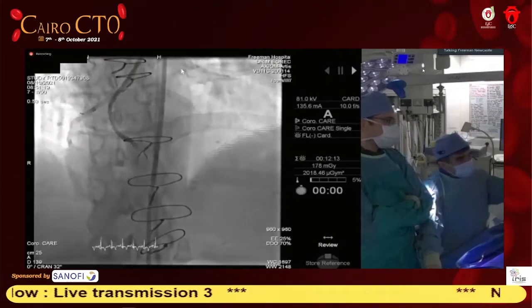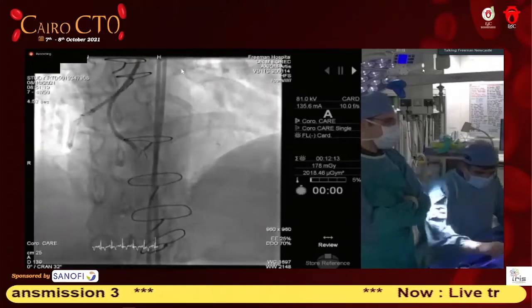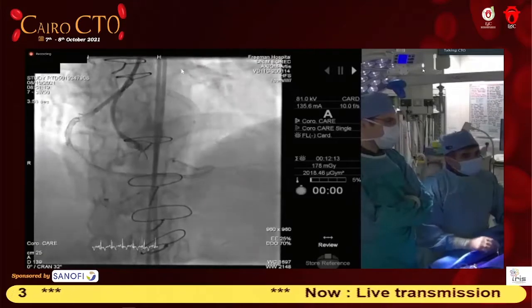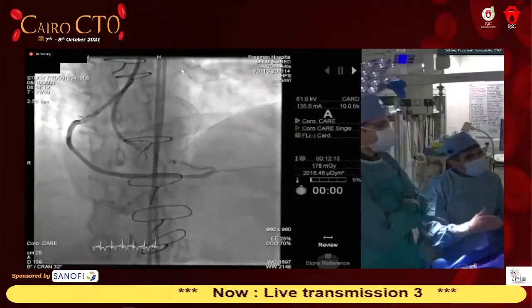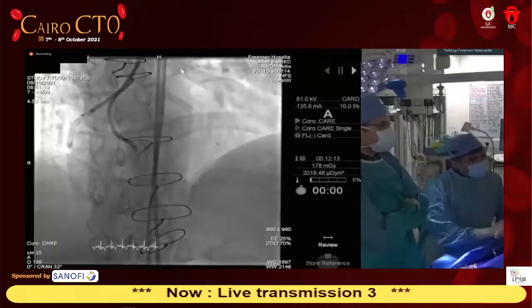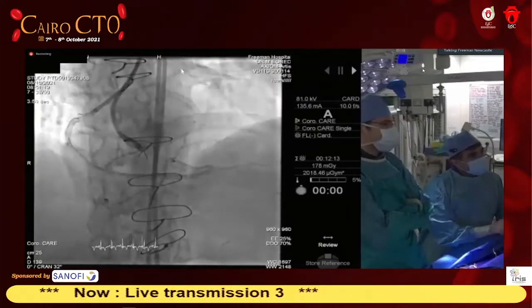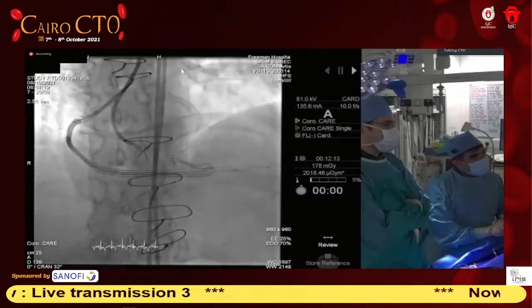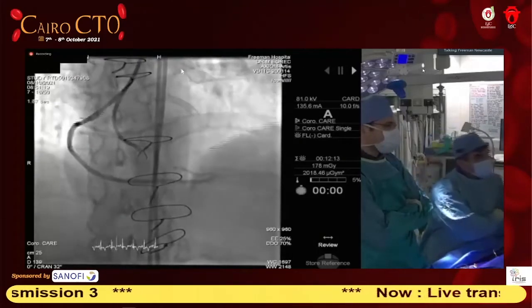So, here's the setup angiogram. Any comments on how you'd approach this or what you would do? Okay, so before we go further, the question is, would anybody do what I did, bring the patient back and open it up, or would you accept the result of the vein graft? So we'll use the vein graft now, retrograde. Yes, that's open to comments, to hear what you guys think.